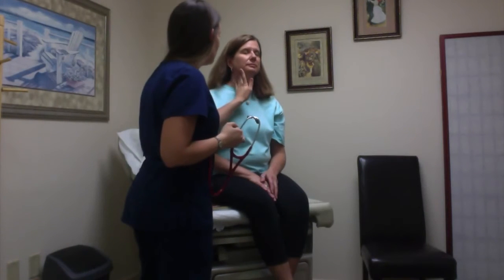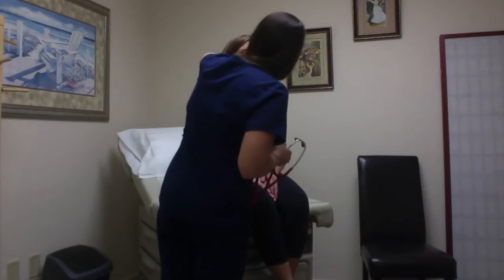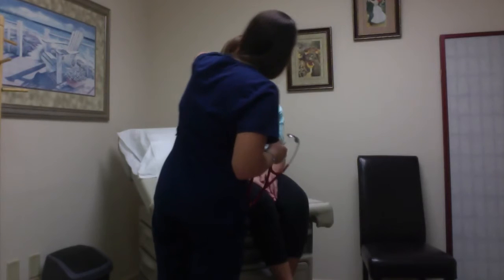Next, I'm going to palpate and auscultate her carotid arteries. I'm also going to palpate the position of her trachea and feel for any enlargement or nodules of the thyroid. So we'll start with the carotids. First, I'm going to palpate. I'm going to listen. I'm listening for any bruit. So I'll listen with my bell.